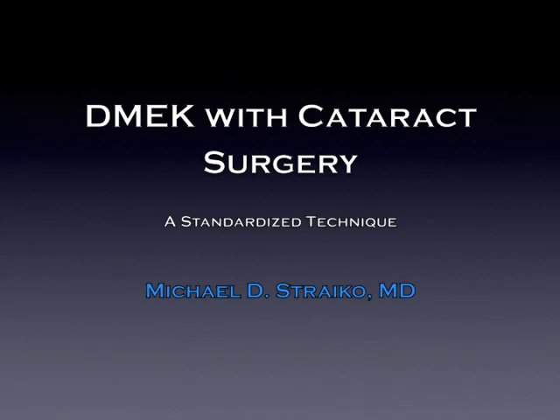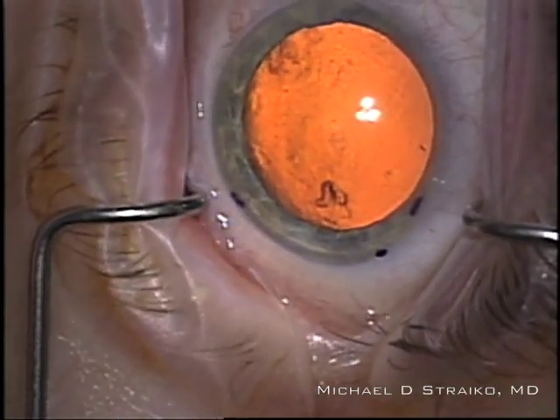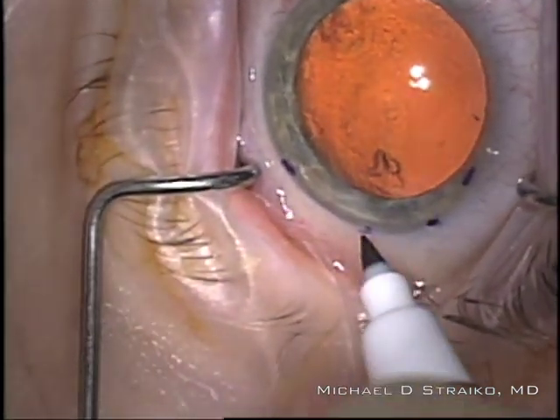Hi, this is Mike Stryko with the Devers Eye Institute in Portland, Oregon. I wanted to share with you two cases of DMEC, or Descemet Membrane Endothelial Keratoplasty Surgery, combined with cataract surgery. Both cases highlight slightly different aspects of the surgery.